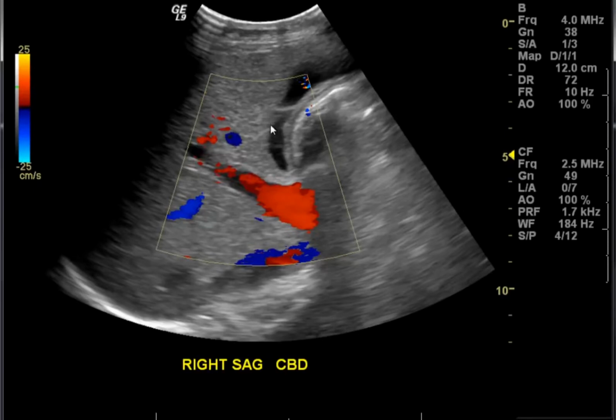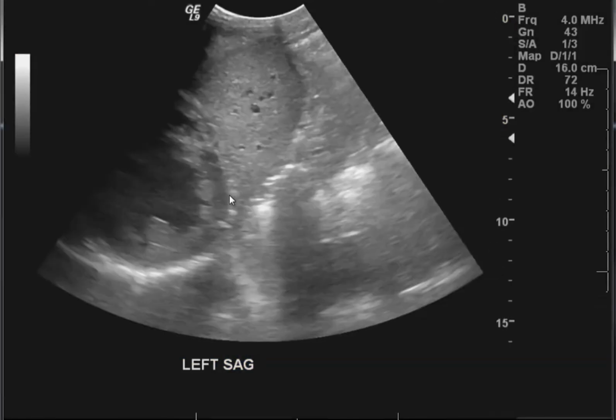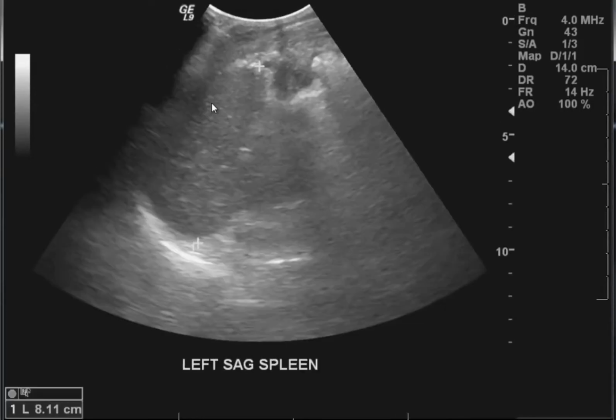Now you can clearly see those artifacts here over the gallbladder area. This patient happens to have a big heart, and we were discussing that he may be in hepatic venous congestion because his liver vessels are kind of prominent, especially the hepatic veins.